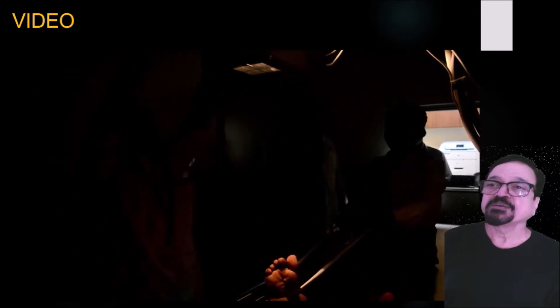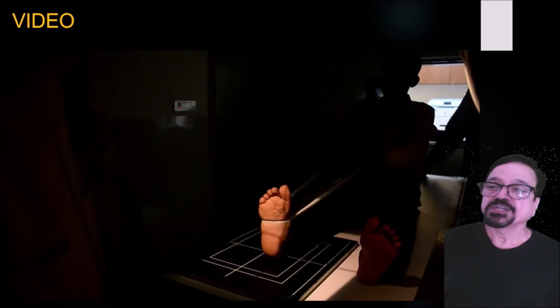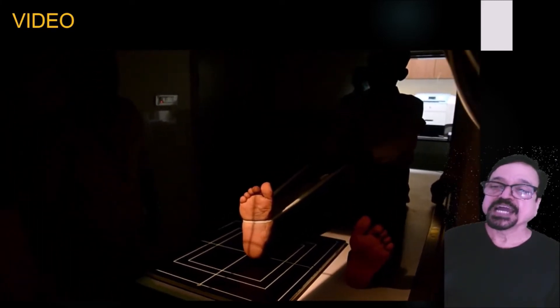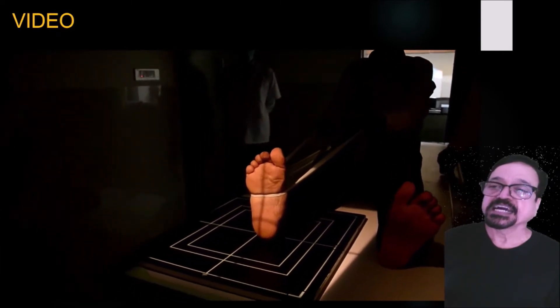When you are giving angulation to the tube, we have to go with a tube angulation of cephalad 45 degrees. That is how we give angulation. The center is kept on the calcaneus — we are centering over the calcaneus and it has to be in the center of the film as well. This is the correct way.